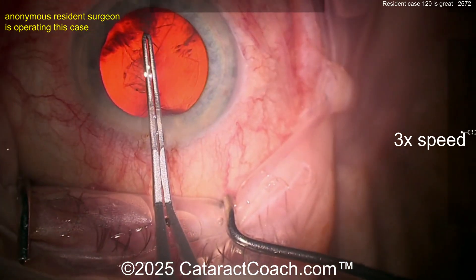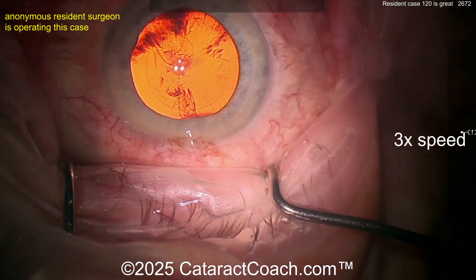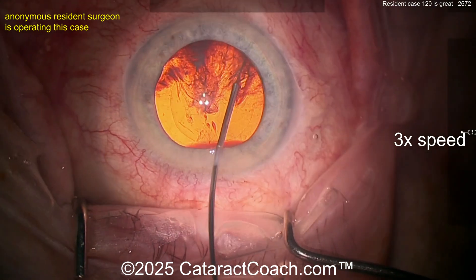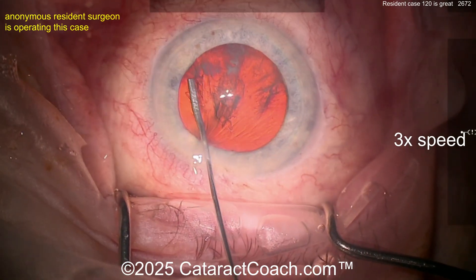Now your rhexis — it's not centered up. Center up a little bit more — there we go. Look at the field, look where the light is from the microscope. You want the eye to stay in the center of that. There we go. Good job on hydrodissection — another wave over on this side as well.